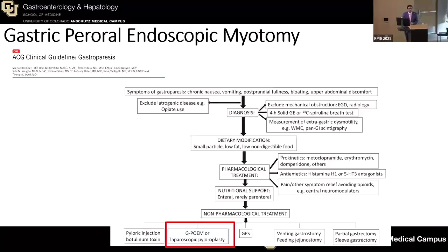So we'll switch now, Garris, to gastric peroral endoscopic myotomy. Again, you saw an excellent demonstration from Dr. Messman about that. This is a little bit more tricky because patient selection is critical, because not all patients with gastroparesis should get a G-POEM right off the bat. And patient selection really plays a role in your outcomes.